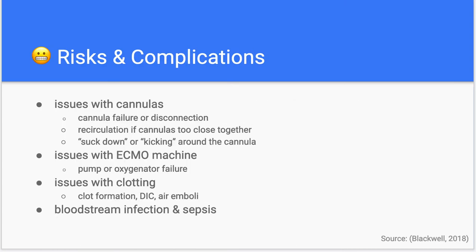So looking at risks and complications, the big kind of most obvious one is disconnection of the cannulas themselves.